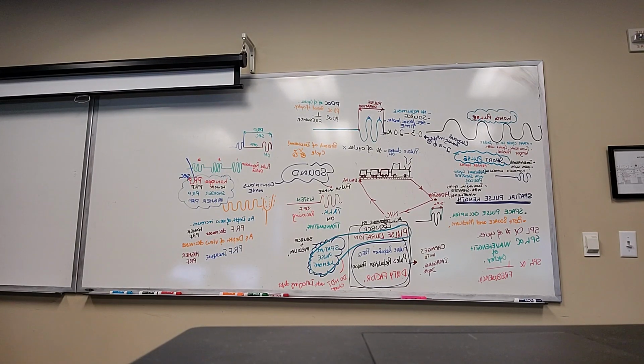So now what's duty factor? Duty factor is a unitless number because it's expressed as a percentage. It's the actual time when the system is on. So it's 0 or it's 100, it's on or it's off, right?